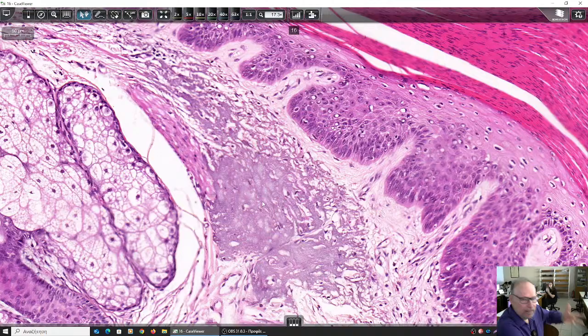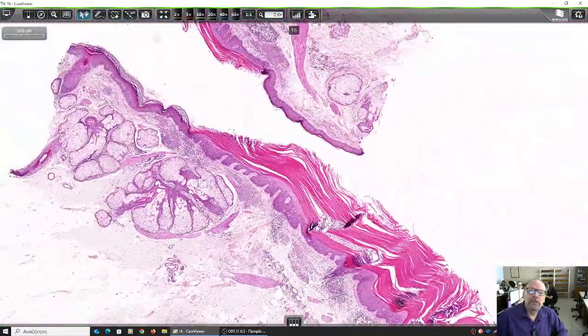That means this is a lesion that has to do with the damage caused by the, how is that, the radiation of ultraviolet? Yes, by that radiation of the sun. So, and what else do we see?